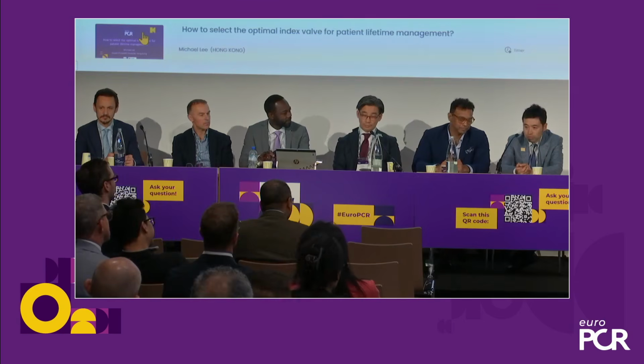For supra-annular valves, we really need to put it lower to facilitate coronary access. Then we will be sacrificing the pacemaker rate. But for this valve, I don't think we need to do that. We just put it in the perfect position. First device and first procedure is very important. 3 to 5 mm would be my suggestion.